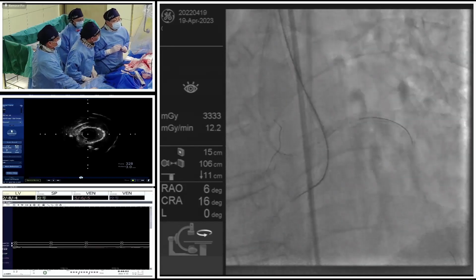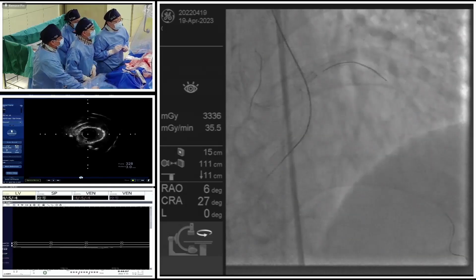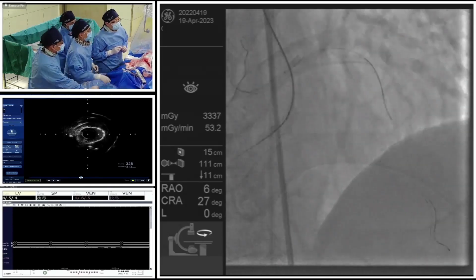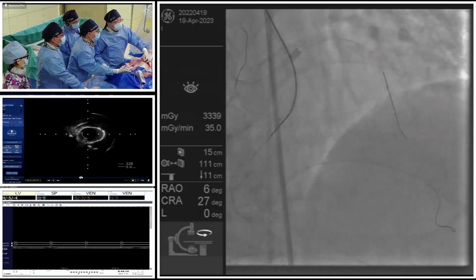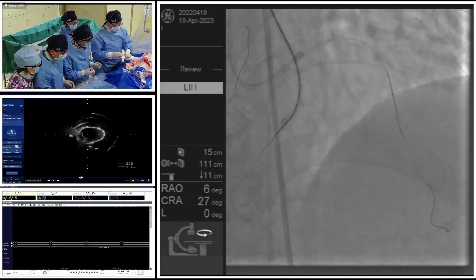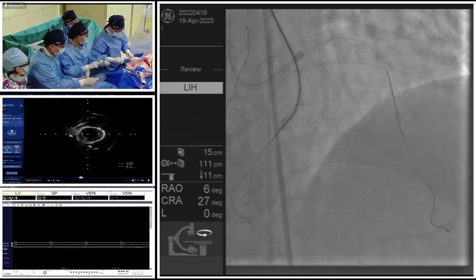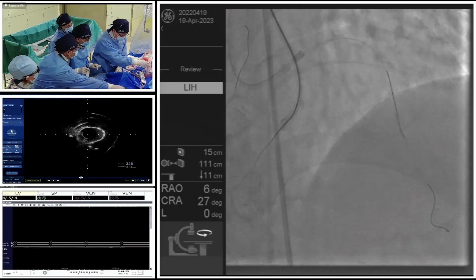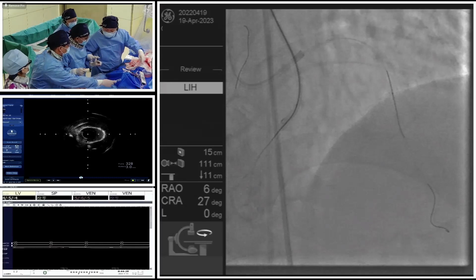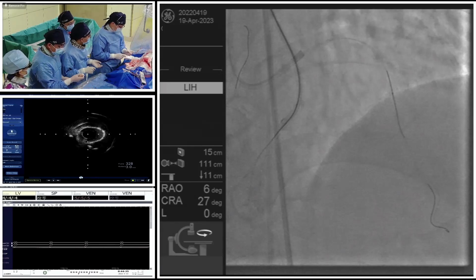So from the baseline angiography this time, we noticed two relatively good collateral flows from the septal to the distal RCA. One is a little bit proximal to the vessel, and another is a relatively distal part. Both septals seem to be CC2 level, with a little bit of tortuosity at the mid part of the connection from the septal to the distal RCA. So we try which one is more friendly to us.